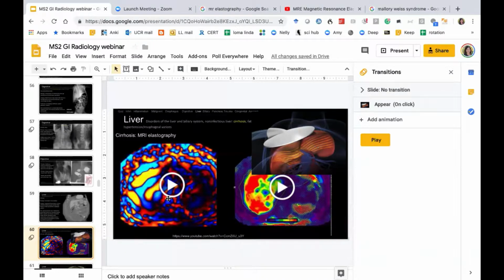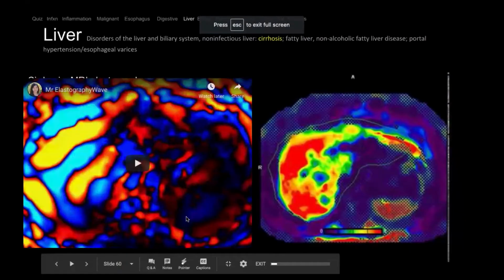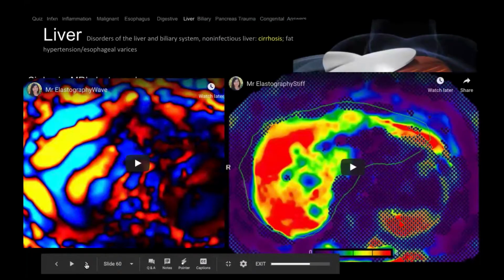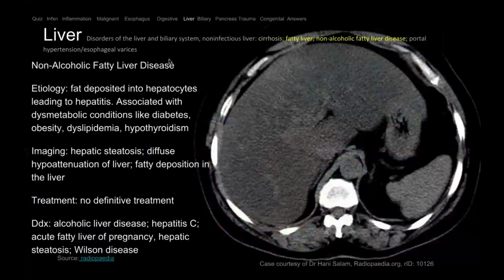And then you can assess how stiff something is in the liver, and actually stage the fibrosis. Cirrhosis is end-stage fibrosis, but there are 4 stages: 1, 2, 3, 4. 2 and 3 are treatable. 4 is irreversible. That's called cirrhosis. You have like bridging fibrosis. So you want to detect it early and use either MRI or ultrasound elastography to assess what stage they're in.